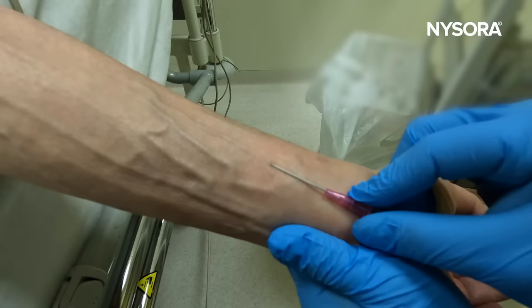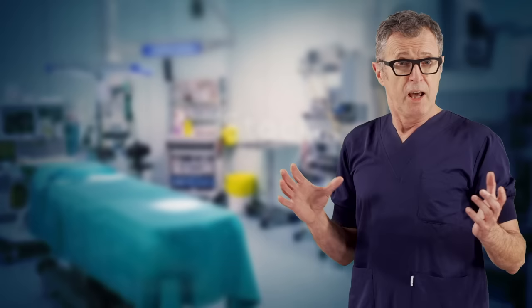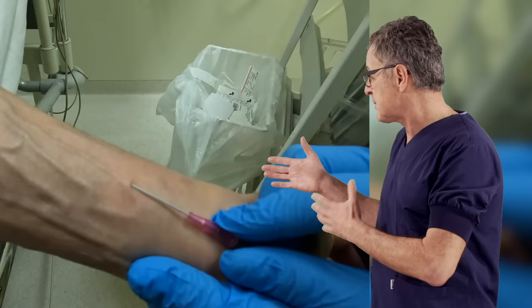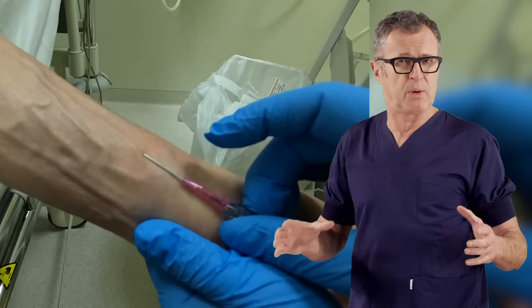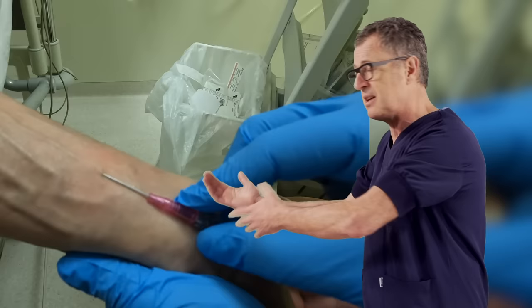Here the operator tries to bend the needle to be able to be more superficial, which is a good option, but not inside the skin or tissue, because the needle remains inserted beside or underneath the vein. This is difficult to correct unless the needle is taken out completely for a new attempt.